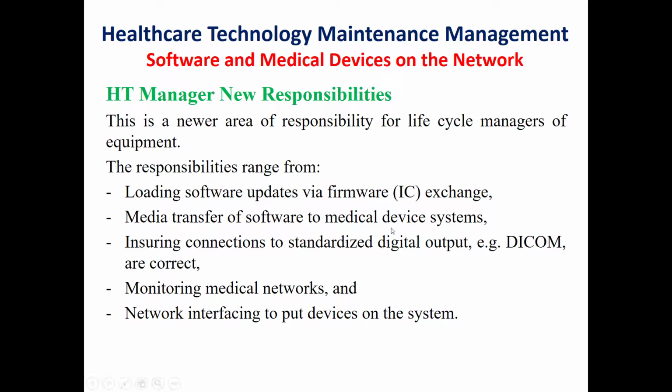Media transfer of software to medical device systems, ensuring connections to standardized digital output are correct, such as DICOM, HL7, which is Health Level 7, and so on. Monitoring medical networks, and finally, network interfacing to put devices on the system, the hospital information system.